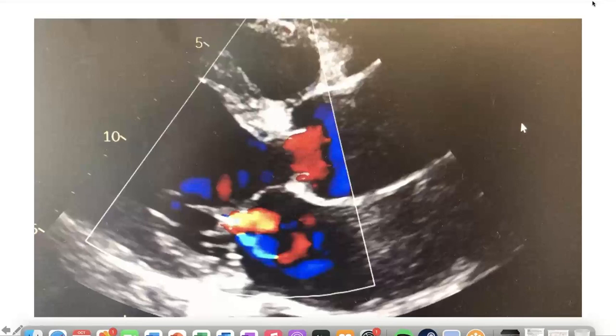And then obviously it starts to then dilate, if you will, in that AP plane. So that's actually quite a later phase in the remodeling process. So, hopefully by getting better volumetric analyses, that may then start to refine who might be an appropriate candidate for earlier intervention. And along with that, I think there's an increasing trend to use things like strain imaging to help us understand more subtle abnormalities in left ventricular systolic and diastolic function, to determine, well, who is that person who, when you're making the decision, might then fail to reverse remodel in the way.